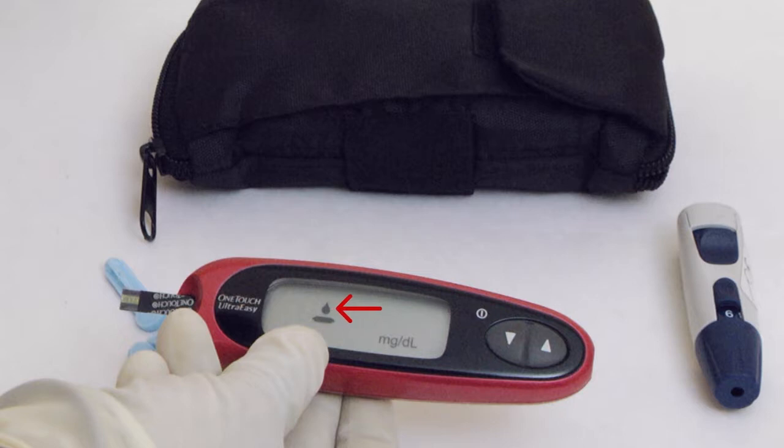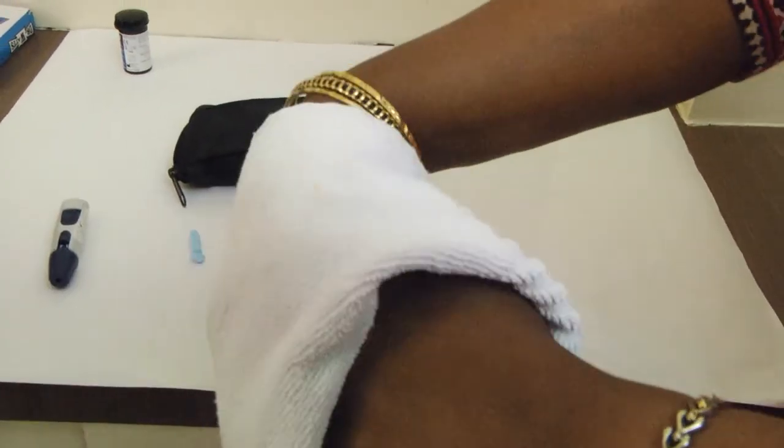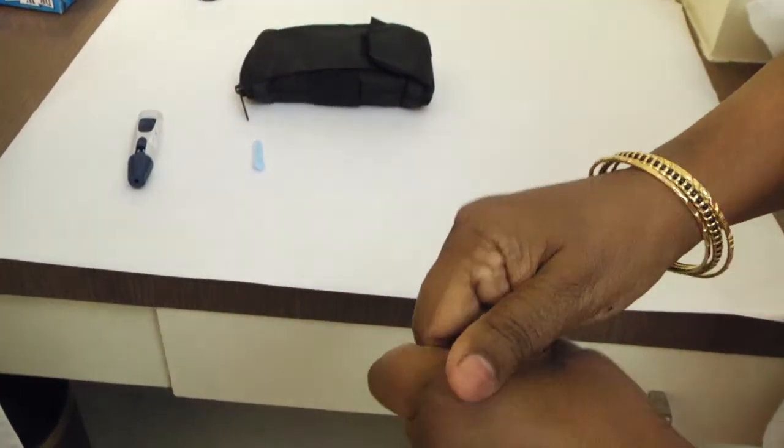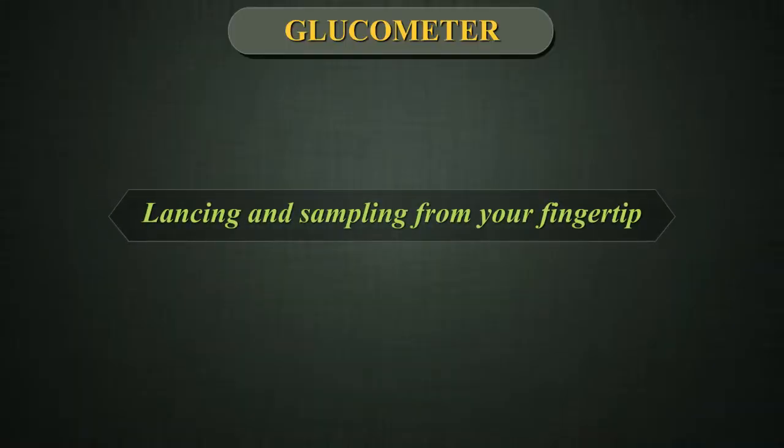The meter is now ready to perform a blood sugar test. Preparing your sample site. Before you test blood sugar, ask the patient to wash hands thoroughly, rinse and dry. Lancing and sampling from fingertip.